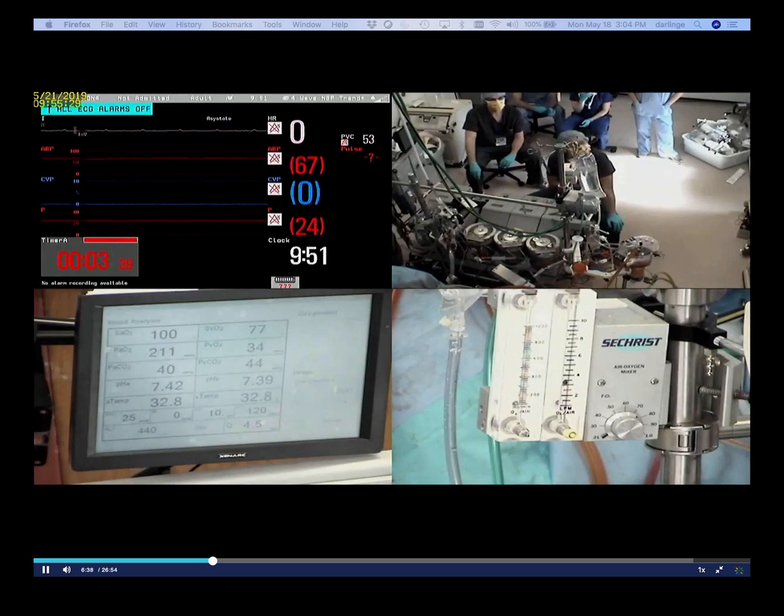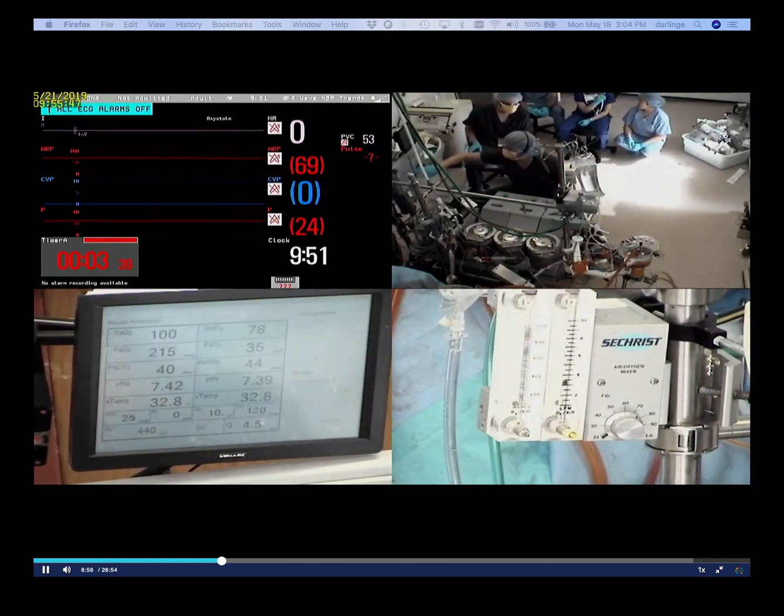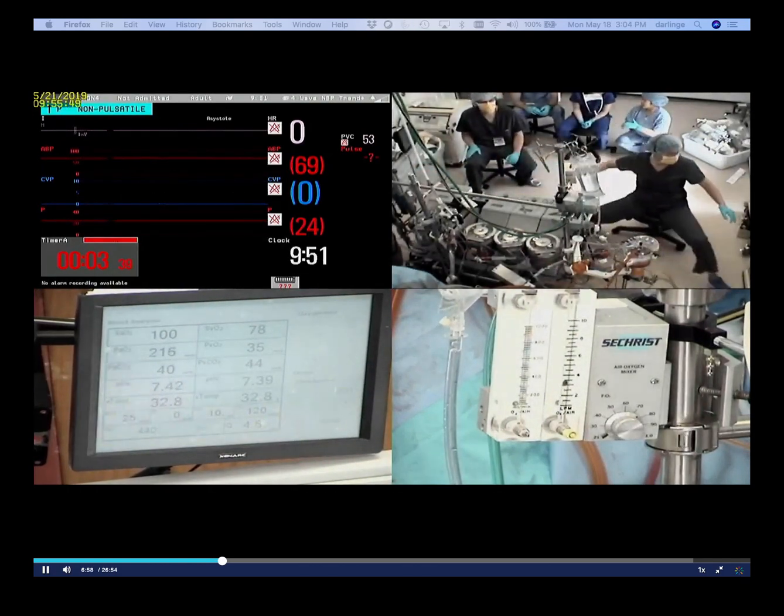All right, that's 300 in and we still have a P-wave. The P-wave is gone — off on cardioplegia. I'll let you know in two minutes for rewarm.